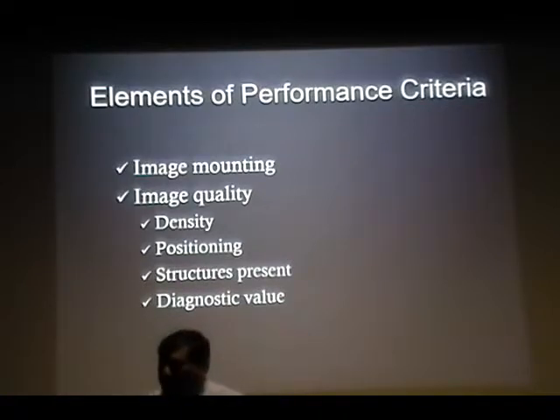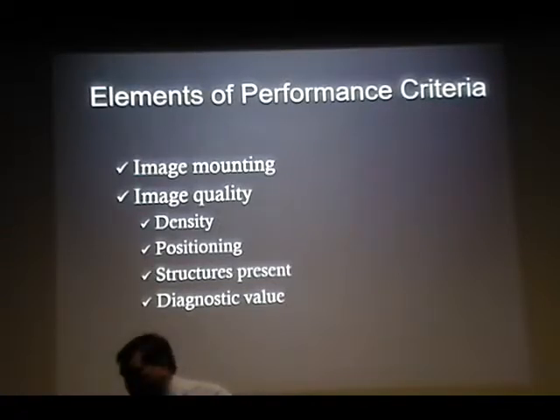Typically we see black, white, and gray. There are some shades of gray, depending on the instrument that you use. At our school, we use 2 to the power of 18. If you multiply that, that many shades of gray, that's what you are going to see. This is critical, because you want to distinguish between enamel, dentin, and pulp, because of the different shades of gray. That's what I mean by contrast.